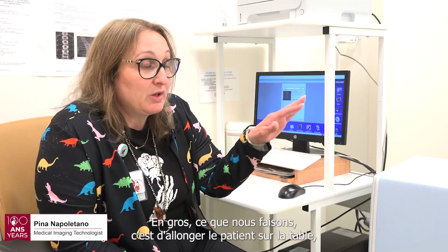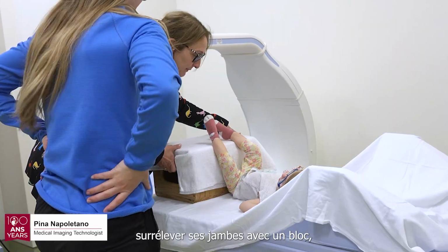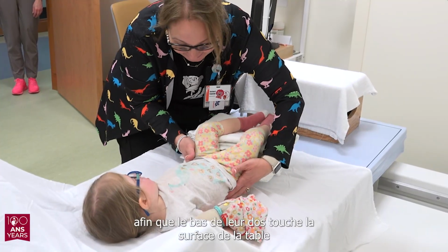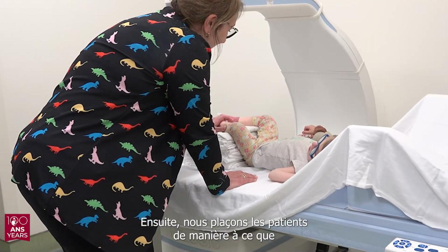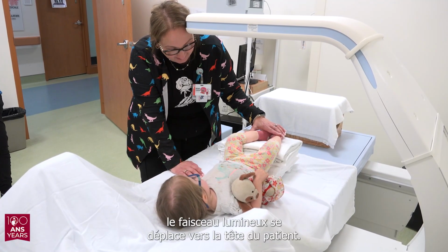Basically what we do is we lie the patient on the table, we elevate their legs with a block. We have 2 different size blocks so that their lower back is touching the surface of the table to have the least amount of lordosis possible. Then we position the patient so that we're able to place the beam and it moves towards the patient's head.